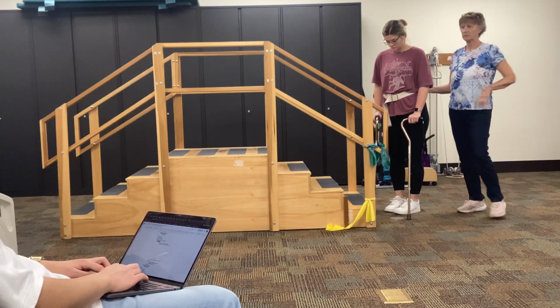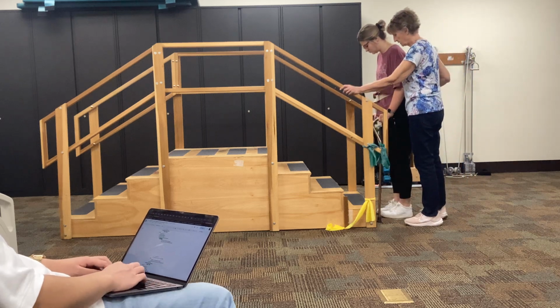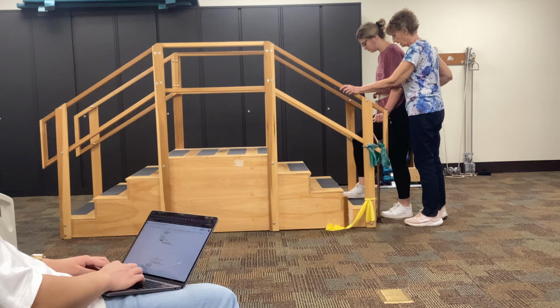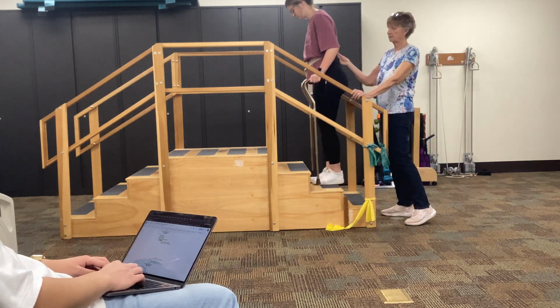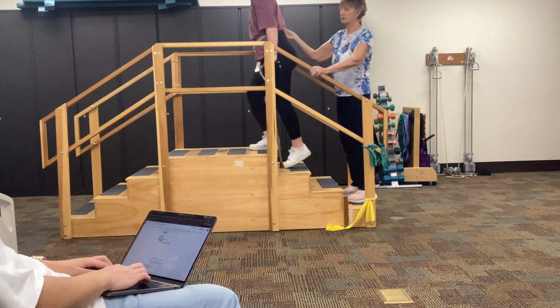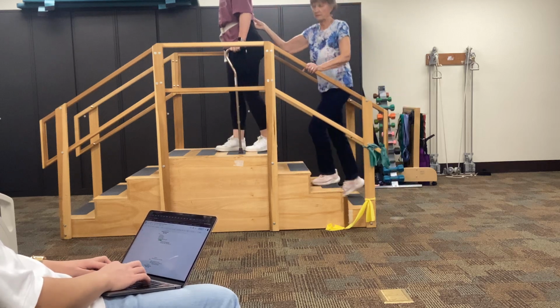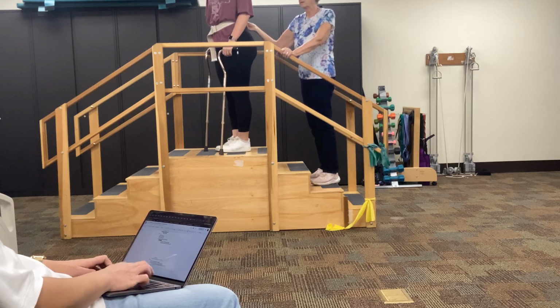So, let's go back to that one. Your good side's your right side, up with the right, and then both canes on the left. Okay. So that would be for the 4-point, and typically they are not able to progress. Okay, come on back in.